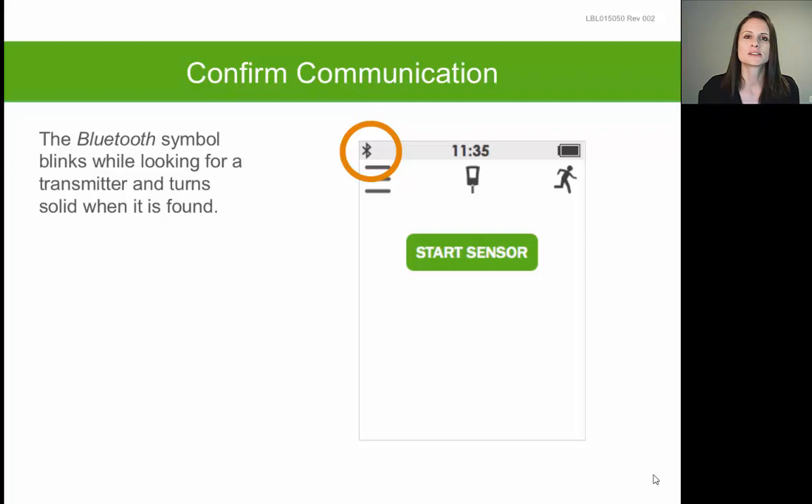Another item you may notice on the receiver home screen is a flashing or blinking Bluetooth symbol in the upper left-hand corner. Your receiver uses Bluetooth technology to communicate with the transmitter that will eventually be on your skin. At this point in the setup, you should go ahead and set your receiver sounds by tapping the main menu icon, represented by three dashed lines in the upper left-hand corner. It may then ask you to tap the displayed numbers one and then two to access the menu options.